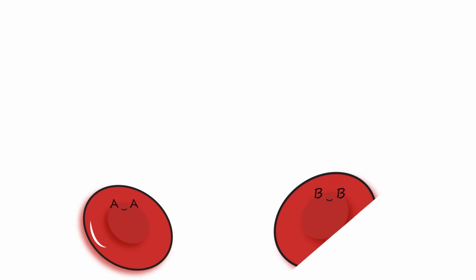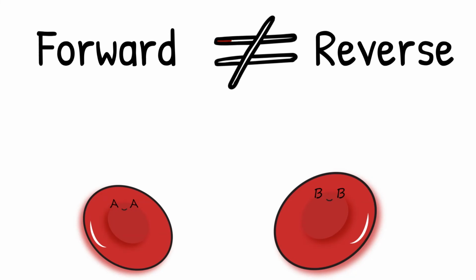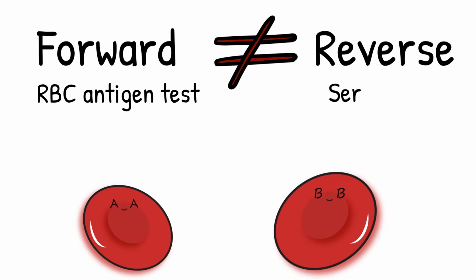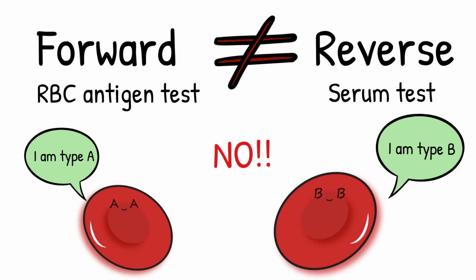In the previous weeks, we have been talking about ABO discrepancy. A discrepancy exists when the results of the forward and the reverse don't agree with one another. The patient blood type is not conclusive. So before we can assign a blood type to a patient, we have to solve this problem. Also, before we can give type-specific blood to a patient, we have to solve the ABO discrepancy problem first, because we want to provide safe and compatible units for the patient.